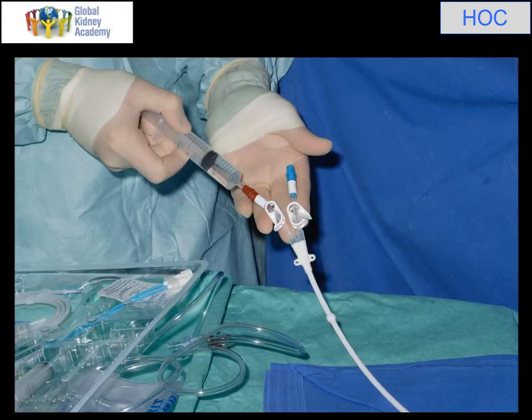On my trolley I've opened up the catheter pack itself. This is what's called a palindrome catheter, made by a company called Covidian. I don't use many of them but I was using them at this time, and it's a good catheter with a completely symmetrical end to it. So although they're marked as red and blue — the red is more brown — the ends are completely symmetrical, and that has some advantages. In preparation I flush each lumen and then clamp it off, and do the same for the blue lumen. I also usually moisten the cuff with some saline.